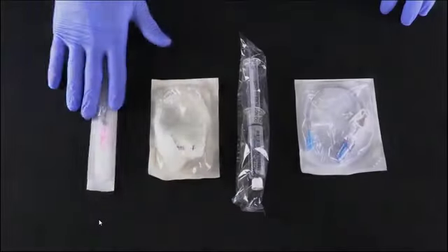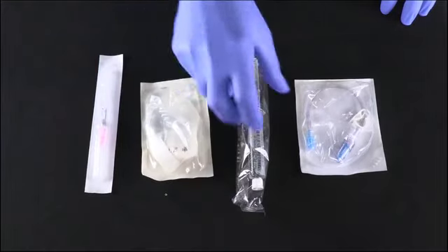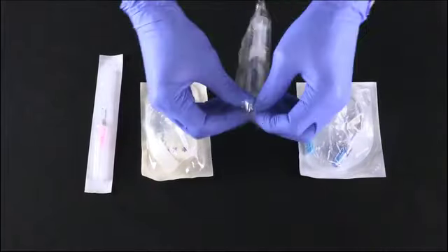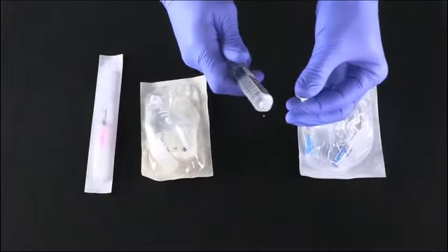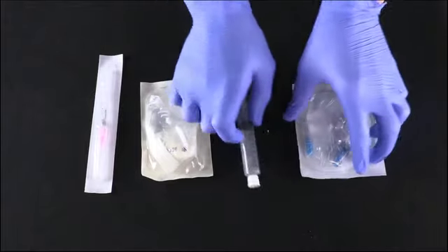Now, like we talked about in the last video, this is everything you're going to need. You're going to need the IV, you need this IV kit, you've got your syringe, and then you've got your extension set. Now let's go over all of these pieces. The first thing you're going to want to do is open that saline flush up. Now, a little tip, most of these have a little seal, and what you'll do is take the cap off and pull back to break the seal, and then you can push the air out. That's usually a really easy way to do it.